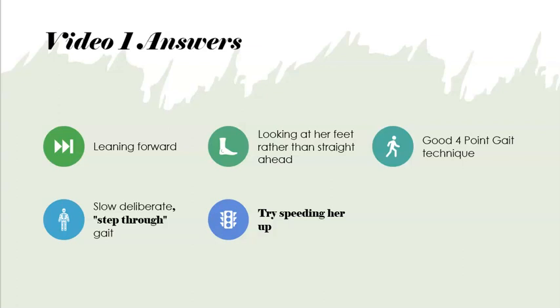But it's worth just bearing in mind that she's obviously quite an experienced amputee, and she's been walking for a while. She's a below knee amputee, so it's going to be much easier than an above knee, but that's a very good example of how to walk there. We won't come on to that too much.